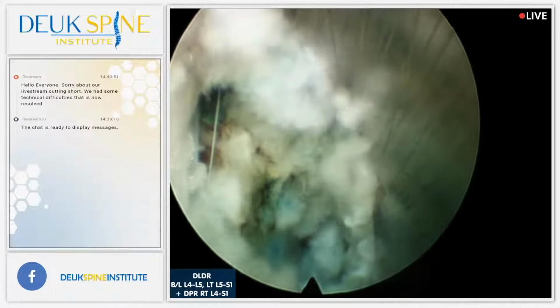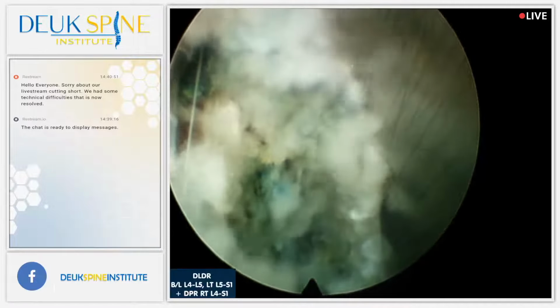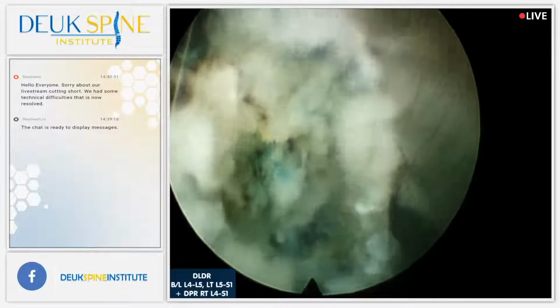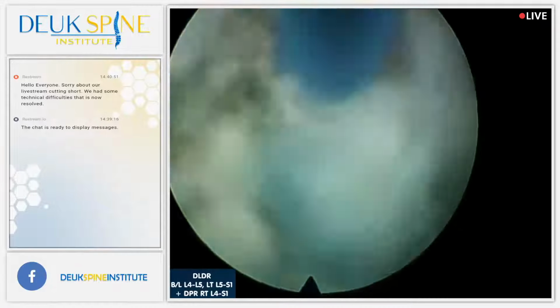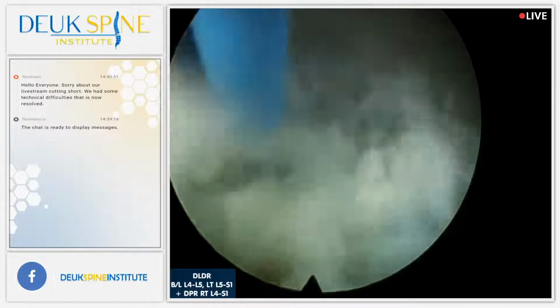Let me know when you're ready. Seems to be settling down a bit. Yeah? Yes. Proceed? Yeah, it's definitely an area that's very sensitive for him on this disc. Clearly a painful area.